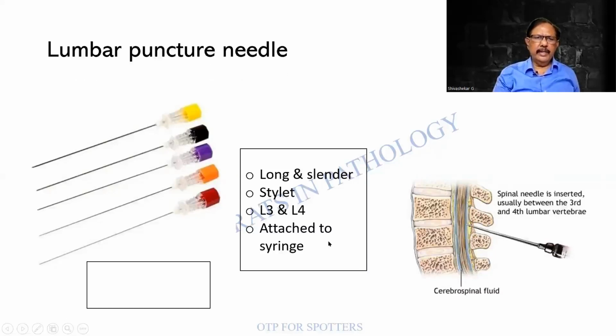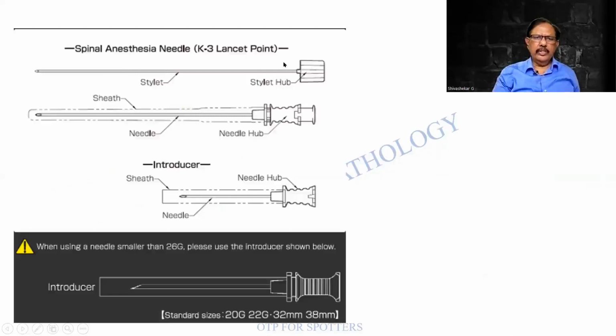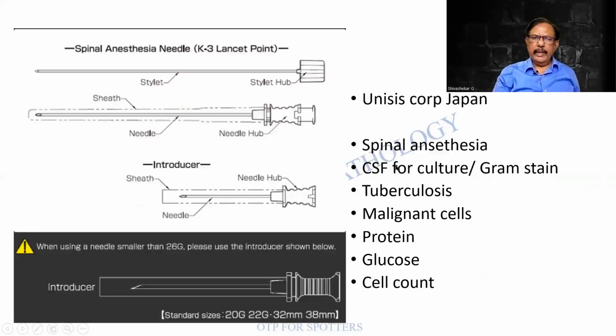It is a lumbar puncture needle, the uses, etc. This is the list of complications: infection, hemorrhage, and herniation of the brainstem. So this is one. One of the students answered as spinal anesthesia. He was correct. That can be one of the uses of the needle. So spinal anesthesia, CSF for culture, tuberculosis, malignant cells, protein, glucose in biochemistry, and cell count in pathology. Lumbar puncture needle.